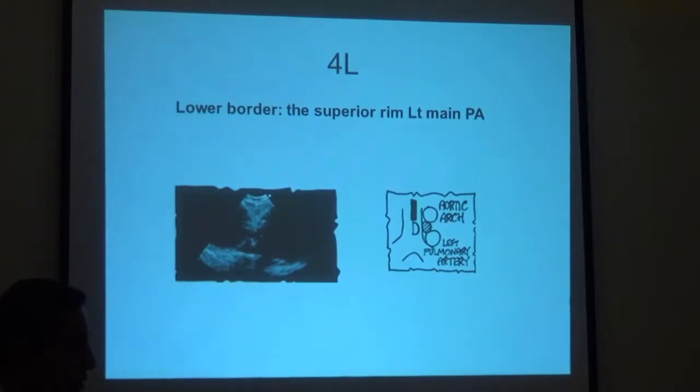So this is the endoscopic view, the bronchoscopic view, sorry, with the ultrasound for the 4L. What you're looking for is what they call the Mickey Mouse ears, okay? This is the upstream, so this is the aorta, and this is the pulmonary artery. Your ultrasound is stuck against the trachea on the lower side on the left, okay? And this is what you're seeing. The aorta is on top, the pulmonary artery is below here. There's maybe a very small lymph node here that would be hard to actually FNA.